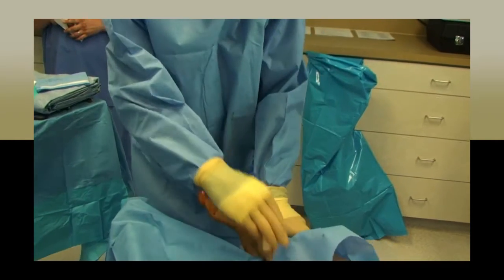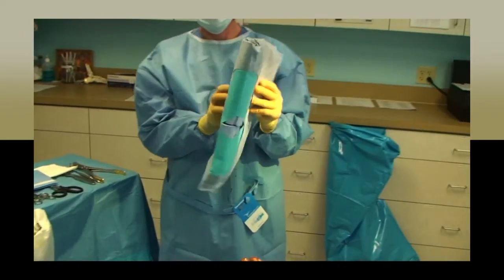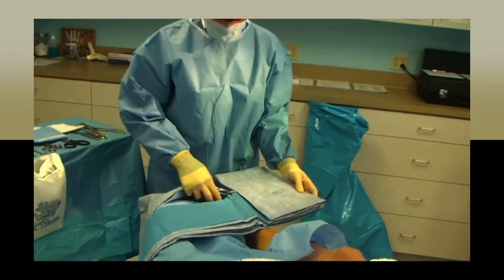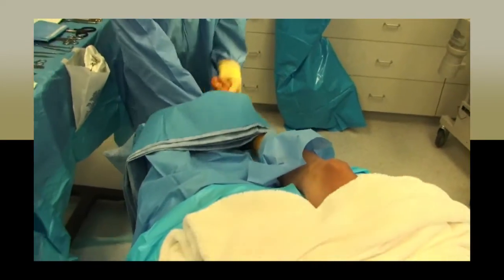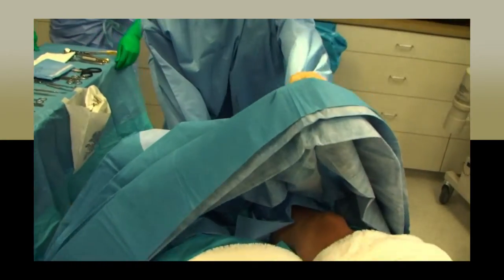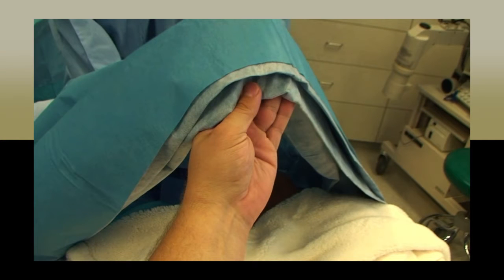When this is in place, you will then take the sterile extremity field off the back table. Following the instructions on the field itself, it will tell you where to put your hands. You will place the leg through the hole of the extremity pack and slide it up until you reach the sterile towel. You will then allow the sides of the field to drop around the table and pull the bottom of the drape to the bottom of the table as someone reaches under the edge of the top part and pulls the field up and over the patient.